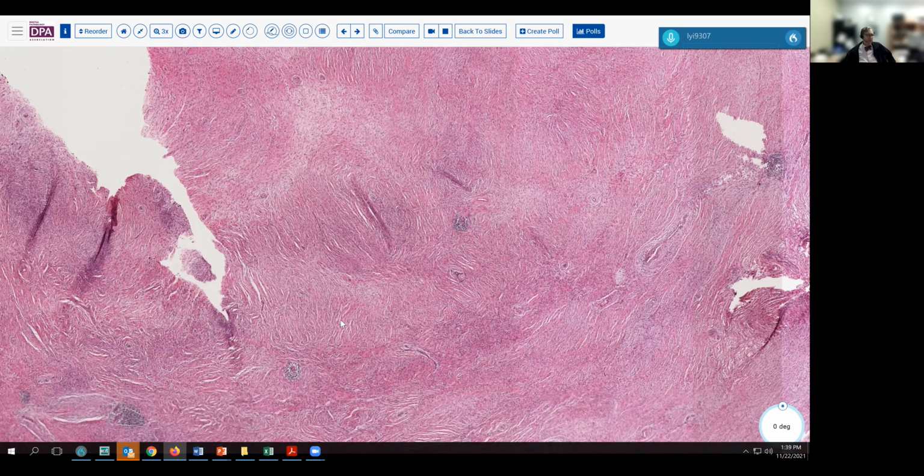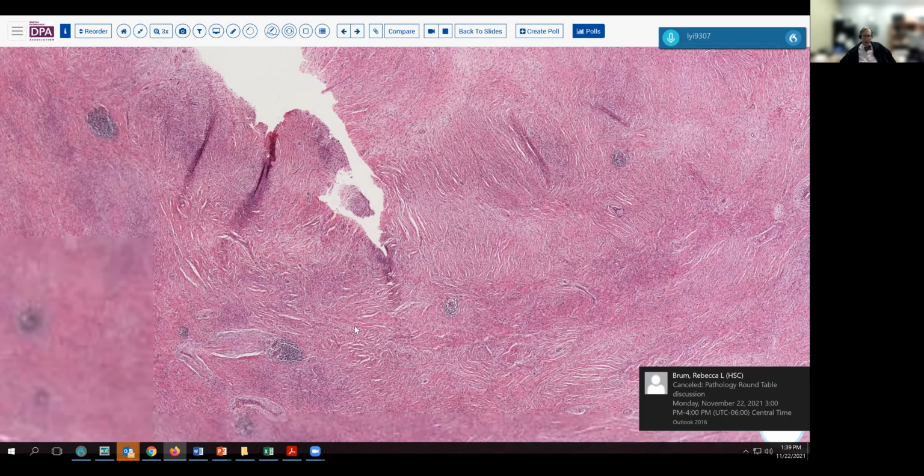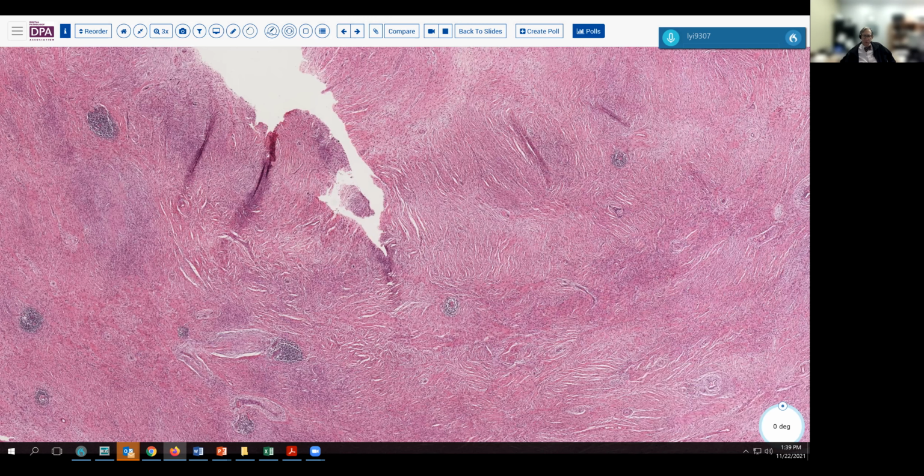These tumors are often MUC4 positive, and they also have a characteristic fusion gene with the FUS-CREB3L2 gene. So that can be demonstrated by FISH to more firmly establish that this is a translocation type of sarcoma and not a fibromatosis.